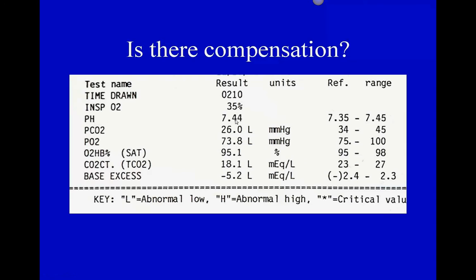So I have an alkaline pH and an alkaline CO2. Now we go to bicarbonate, and the bicarbonate is low. That would move the pH in an acid direction. So I have an acid here, an alkaline here, and an alkaline here. So which system broke to cause an alkaline pH? Well, the one that's broke is the one that matches it.